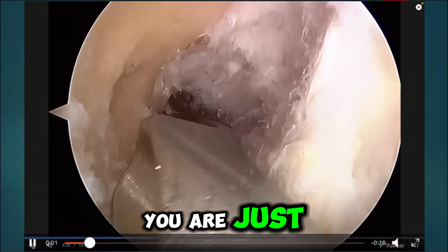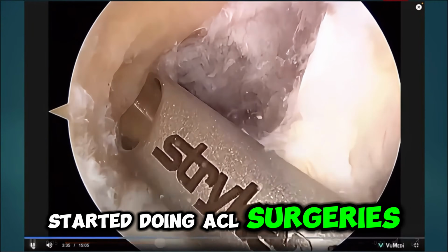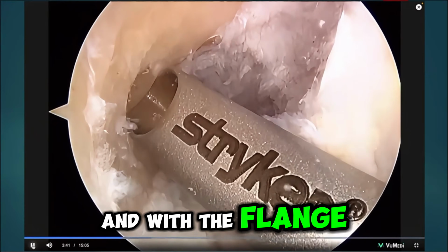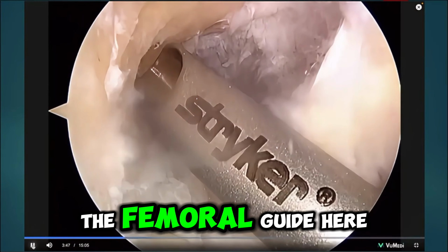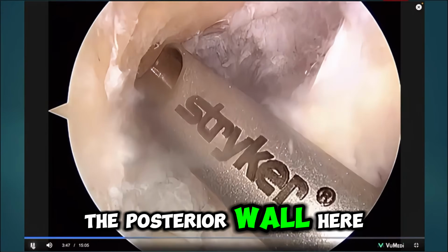And if you have just started doing ACL surgeries, just use one femoral offset guide. This is one Stryker one, and with the flange, just place that flange over the top position, and you can just make the femoral tunnel here. No need to worry about the posterior wall here.